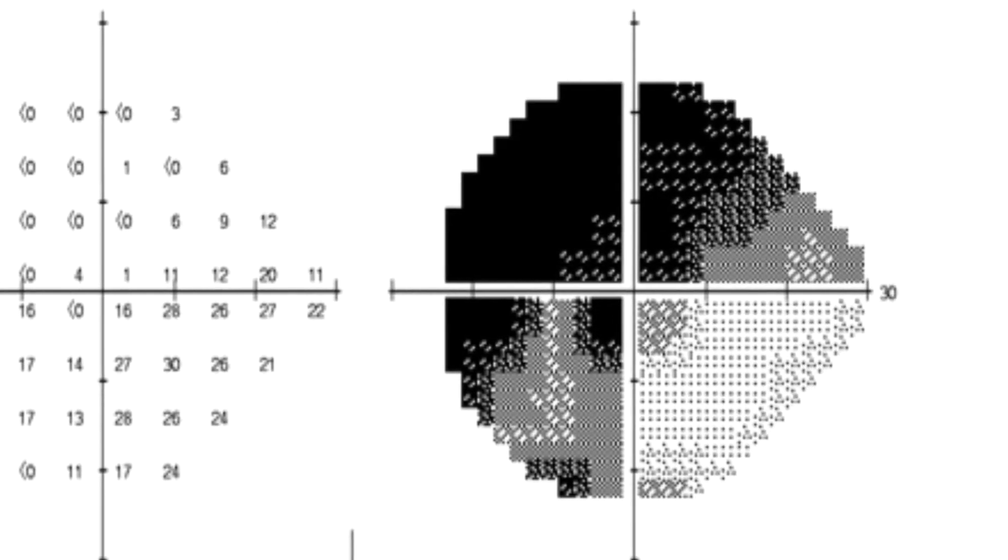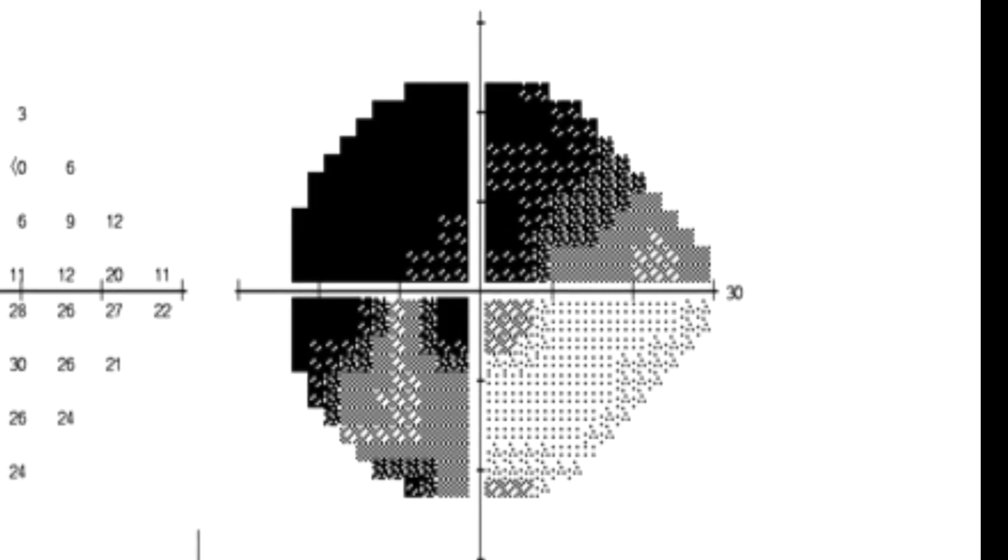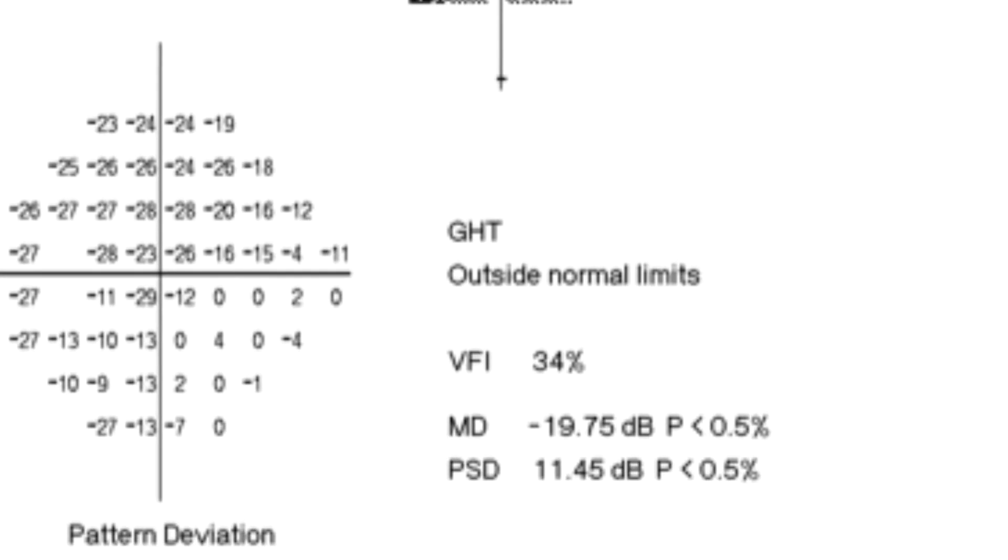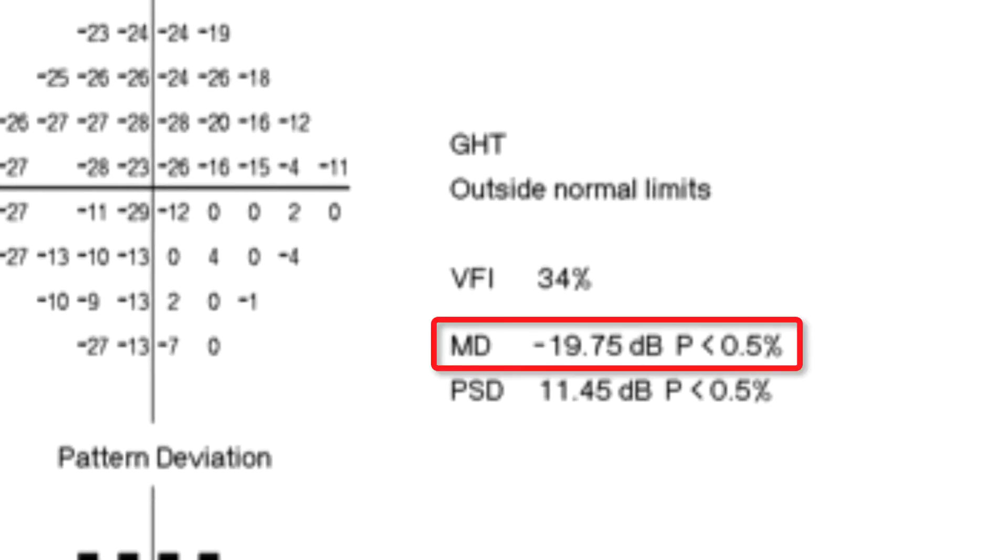Your gaze will naturally go to the grayscale plot, which shows the areas of worst sight in deepest black. By looking at those areas, you can get a quick impression of the pattern of visual field defects. At this point, I usually cast a glance at the mean deviation, which is an average score of the patient's performance. The higher the minus number, the worse the performance.